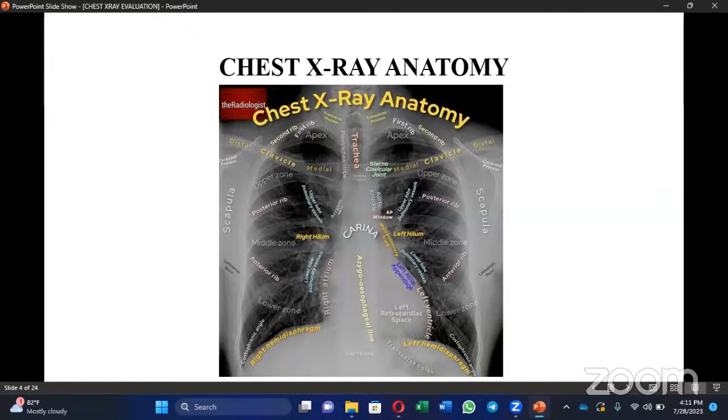Yes, sir. So now, an overview of the chest X-ray anatomy. It is very important, just as I said earlier. So let's do a little bit of the part and then we proceed because of our time. All right. So as I said earlier, with respect to the basic radiographic densities, any dark shading within the radiograph represents an air-containing structure or air-containing anatomy, okay? So let's start medially. I hope you can see my cursor. Yes, sir. We can.